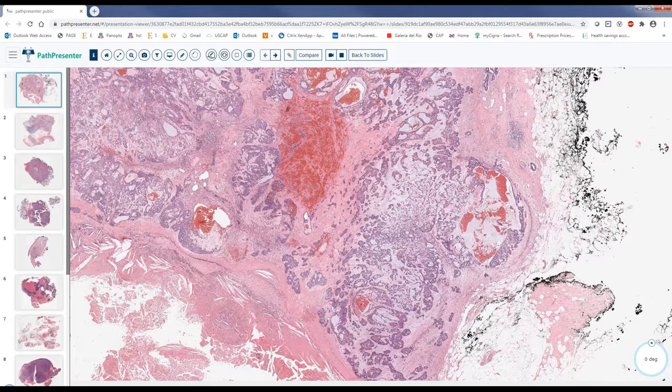You can go first with the radiological features. They will tell you, this density, probably it is a pleomorphic adenoma, and there are areas, or there are no areas or problems or any transformation. So they'll give you that description first, and you can go, and most of the time we don't do immune stains. Just be thorough with your examination.